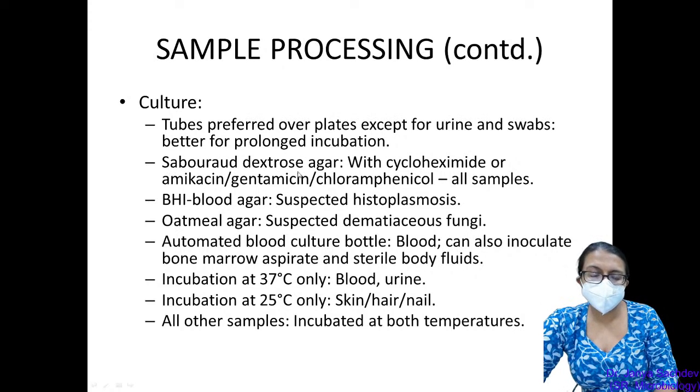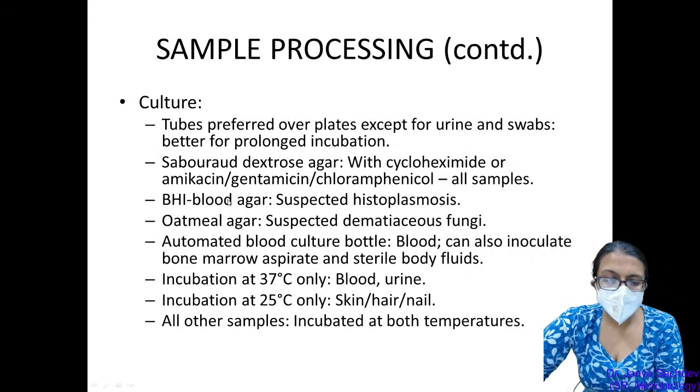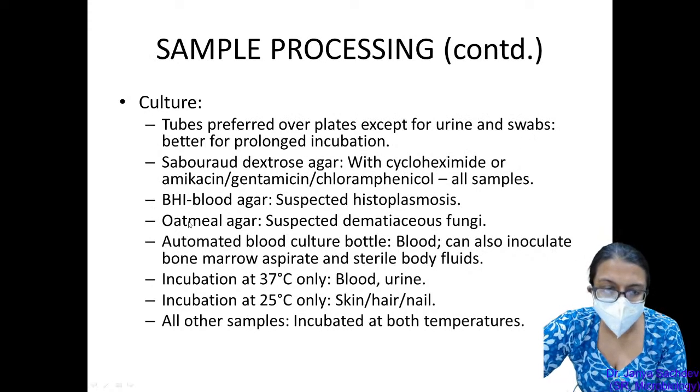These drugs, the antibacterials, are all to prevent growth of bacterial contaminants. So Sabouraud dextrose agar is used for all samples without exception. The only samples where we use plates rather than tubes are urine and swabs, because those are only incubated for a few days, not more than that.